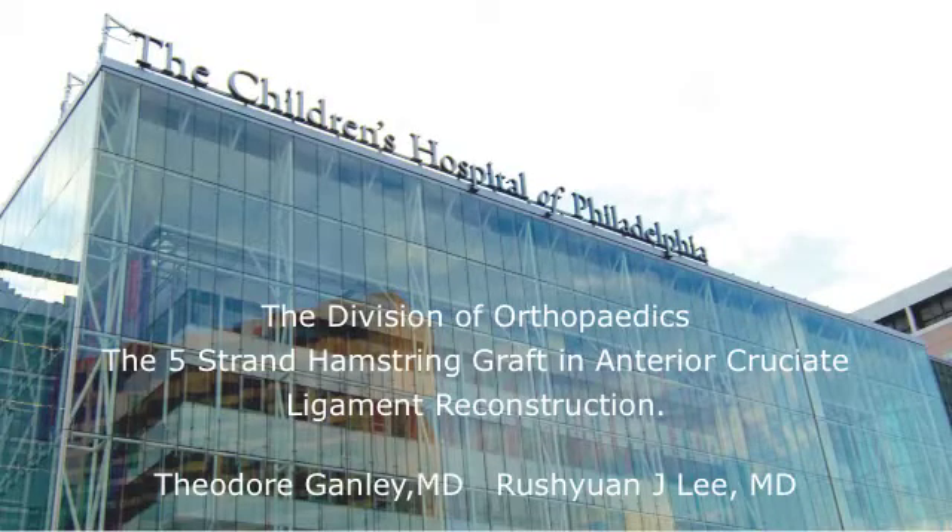This is an instructional video on the preparation of a five-strand hamstring autograft for ACL reconstruction, presented by the Department of Orthopedics at the Children's Hospital of Philadelphia.